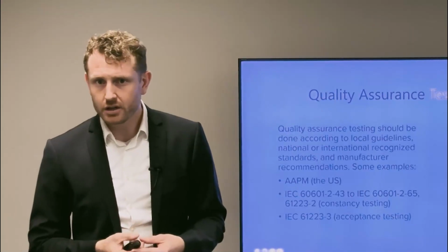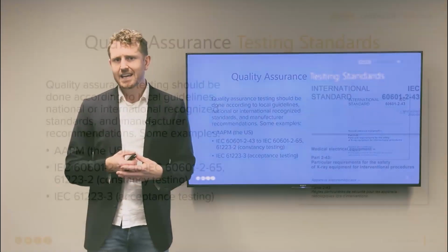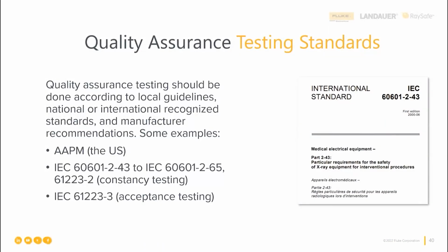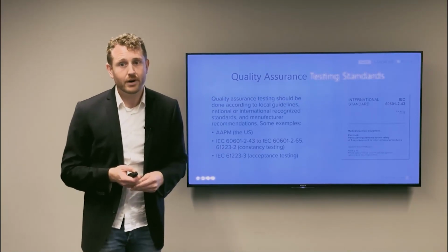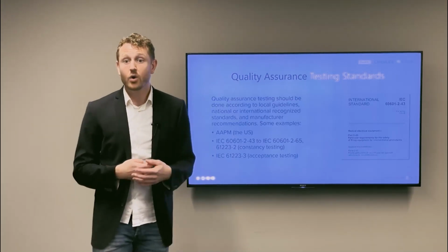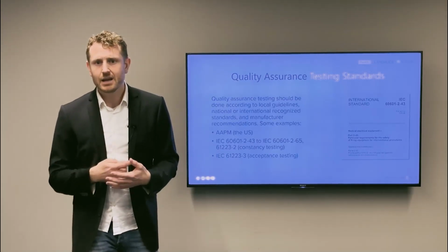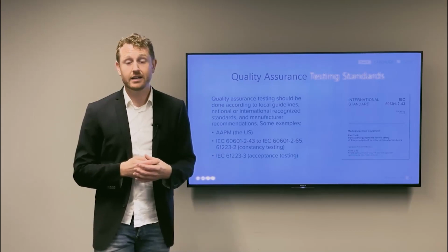Finally, we will conclude this webinar with just a few words about standards. QA testing is regulated by law to ensure patient and staff safety. Regulations differ depending on country and sometimes even region. It is therefore of utmost importance that medical physicists, radiation officers, or whoever is in charge of these questions at the hospital is well informed about regulations. If the regulations do not specify a certain method on how to do a certain measurement, the same person must create the method him or herself, and make certain that it is fulfilled.